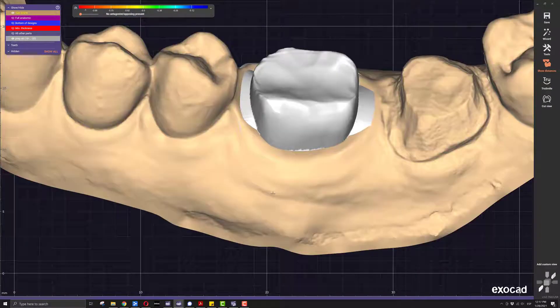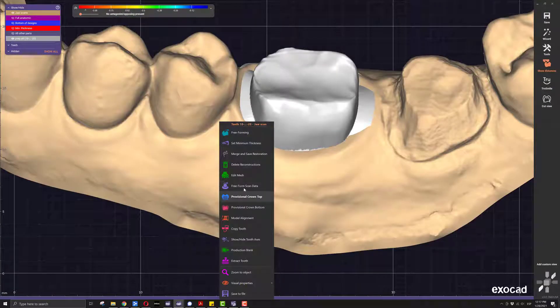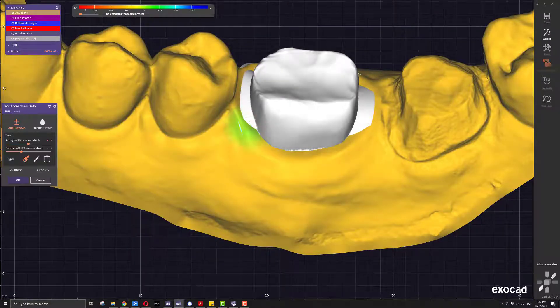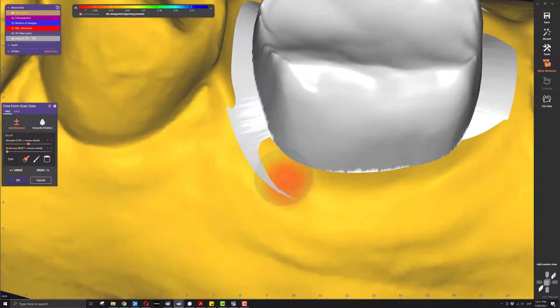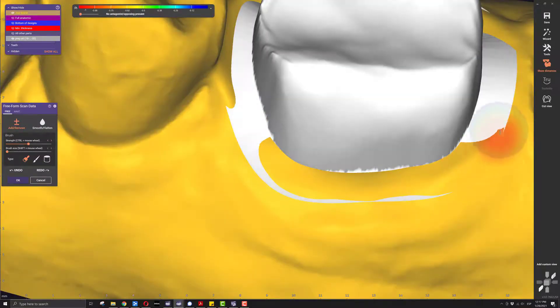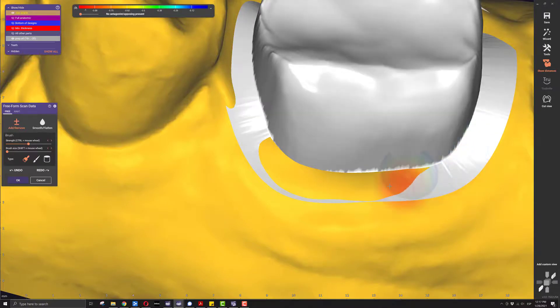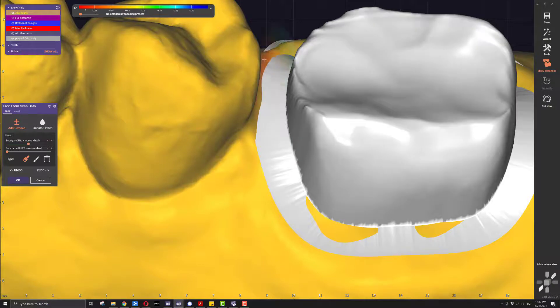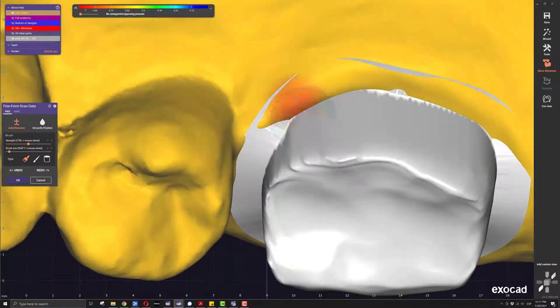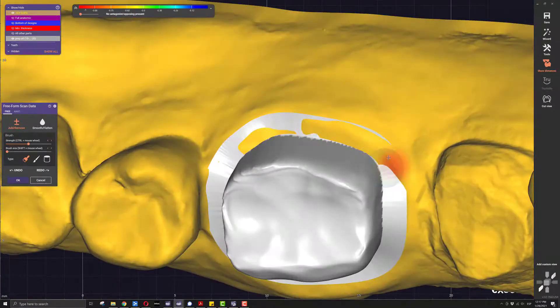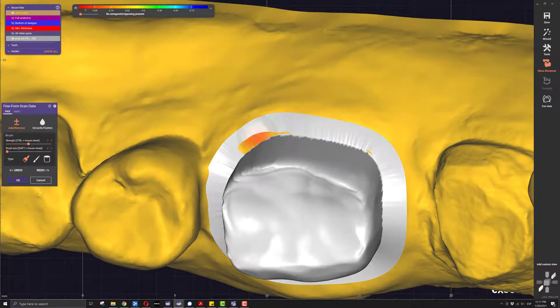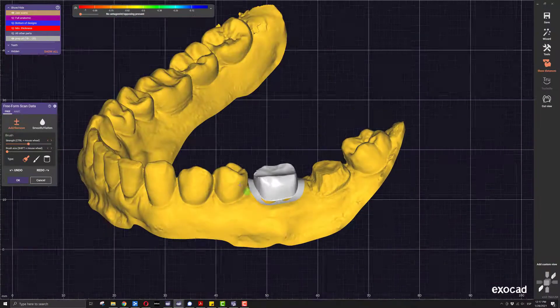Now that we have this, we go into the free forming of the scan data and just clear all of this extra mesh that's blocking the margin from being visualized. We can do this — probably with a little more care to make it more precise — and that's pretty much all we need.